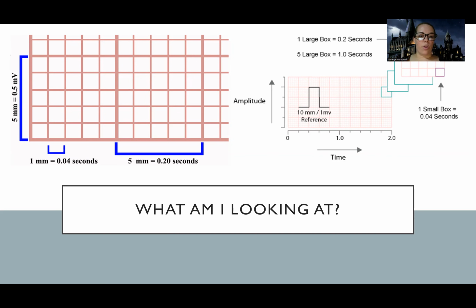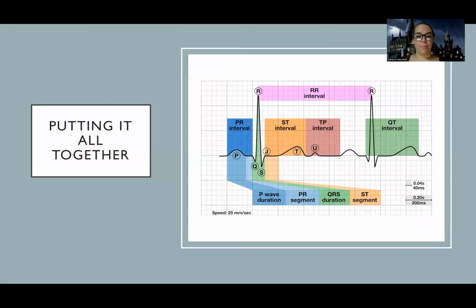So we usually like you to know what a normal QRS range is. Now, I'm not guaranteeing or promising that's the only ones you need to know, but those are probably two of the most important ones. But I have some EKG worksheets on my Google Drive that maybe will help you to think of what are some common or important intervals and distances to know.